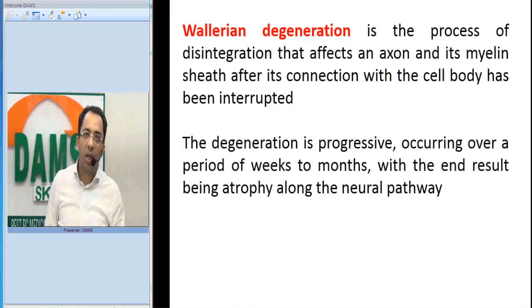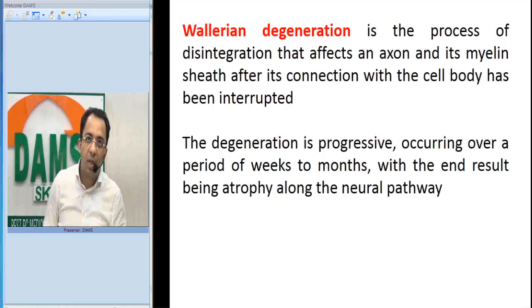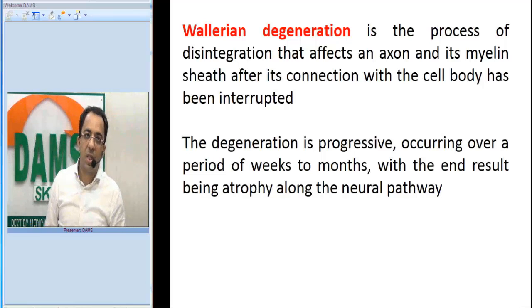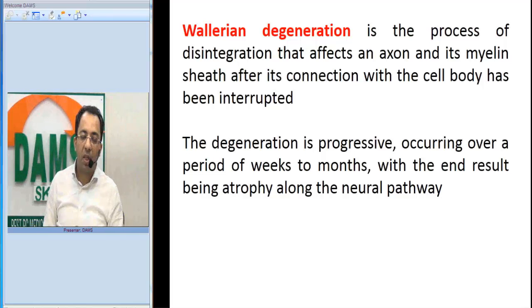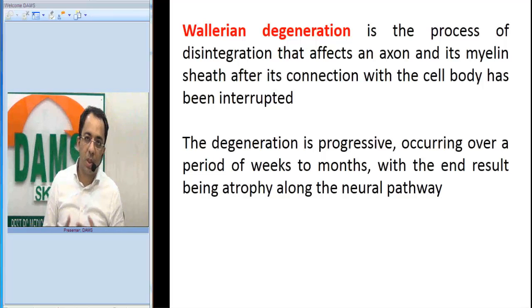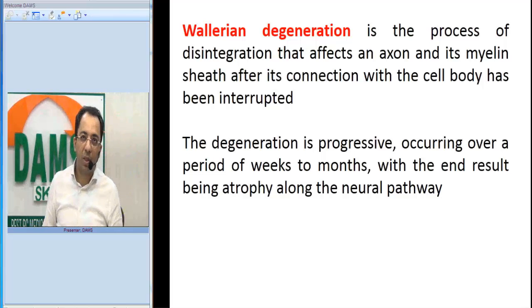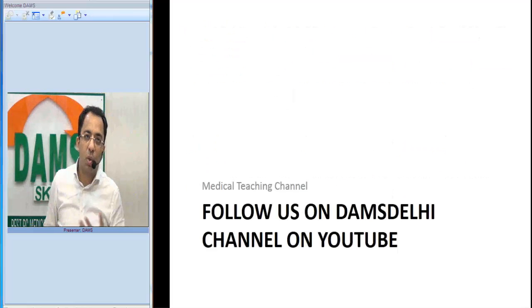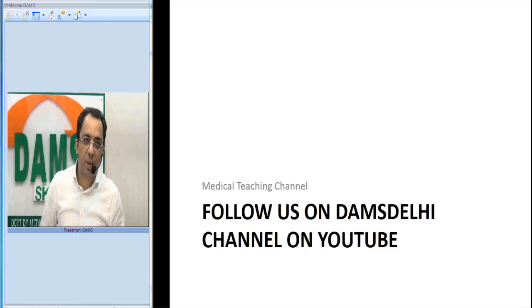So what is Wallerian degeneration? Wallerian degeneration is a degeneration that affects an axon and its myelin sheath after the connection with the cell body has been interrupted. It is a progressive process occurring over a period of weeks or months, and in the end you see atrophy of the neural pathway, as seen in this patient.